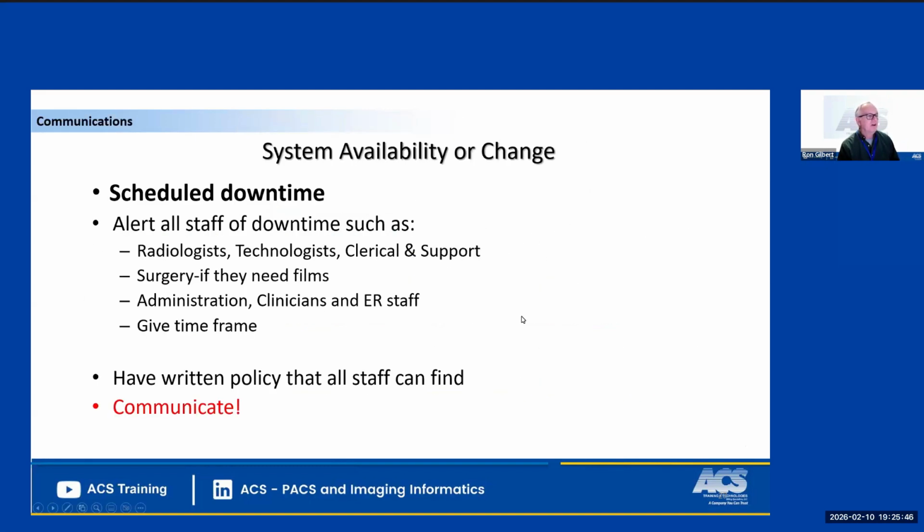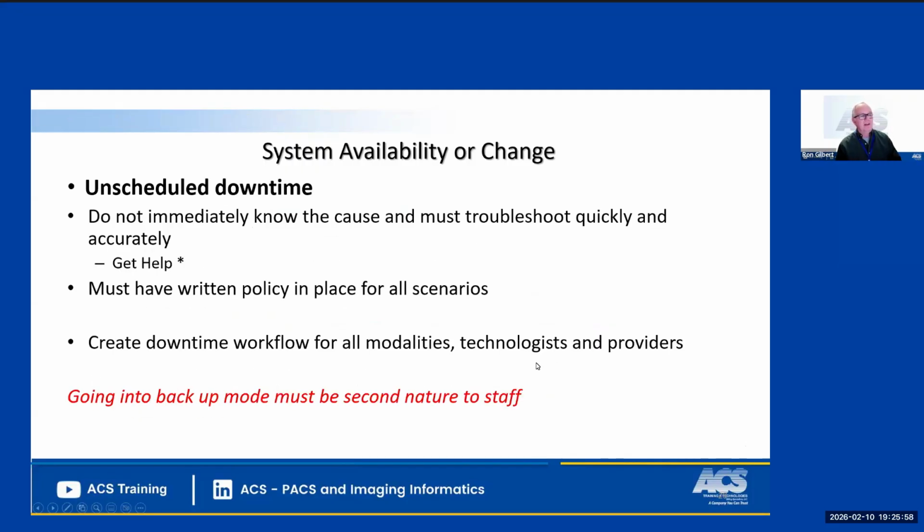So that is how you can function in downtime. Scheduled downtime is when you're going to make changes to the system. And we're going to show you all the planning that goes with that. That is a good thing, because you can't just not change the system or not update anything. So this is something you're going to have to learn how to manage. And also unscheduled downtime, well, this is when you've got to react quickly. You don't automatically know what's wrong with it because you didn't set it up. Something just decided to show its head and you had to go find out what it is. But you also need to create a downtime workflow so the technologists and patients can still be taken care of.